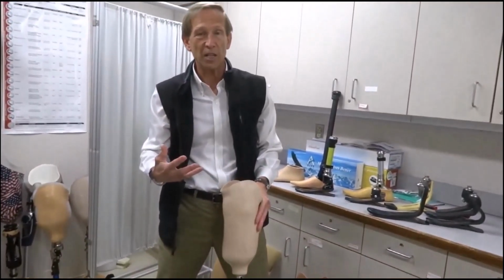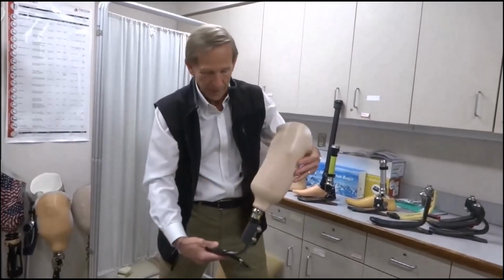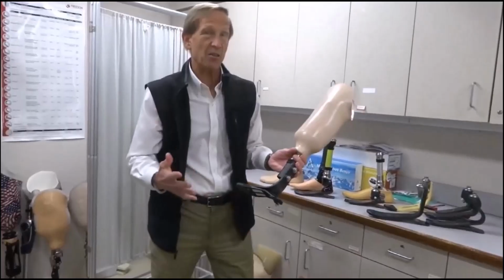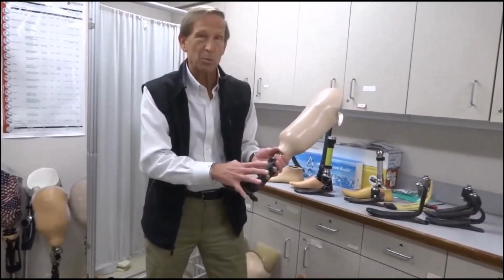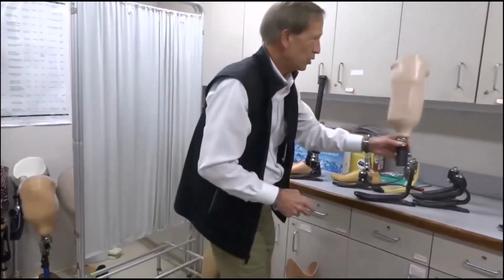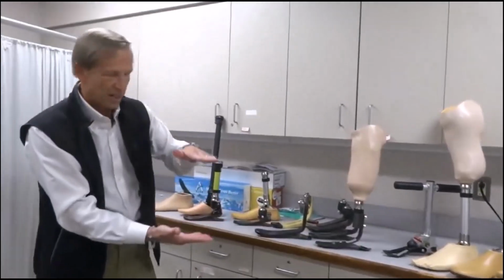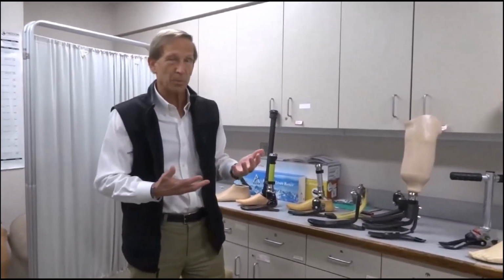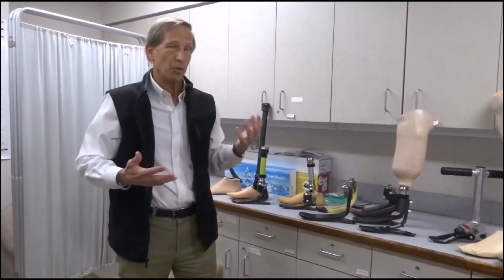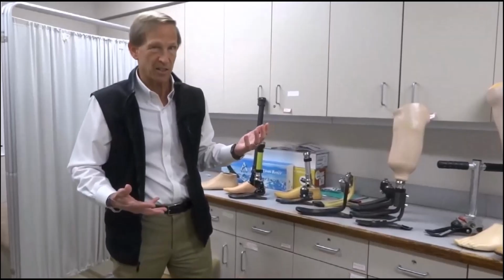These are still very lightweight, but becoming very expensive type of feet. Now we are spending in excess of $1,000, $2,000, even up to $10,000 for just the prosthetic foot. And they do come in a variety of configurations. They allow for different height. They allow for different activity levels, for running and jumping. They allow for different weight categories, typically up to 300 to 400 pounds if necessary.